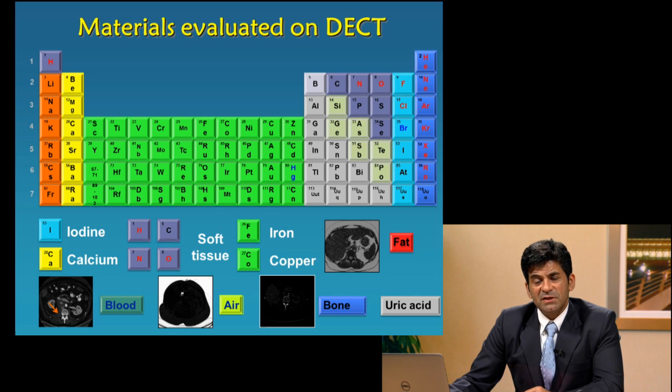There are contrast materials that can be generated with new materials, and that will create new opportunities for imaging with CT. We might have in future opportunities to do molecular imaging, which is currently a domain of PET or MRI.